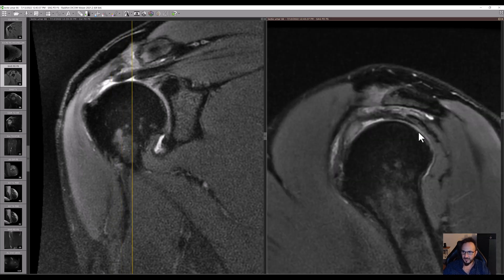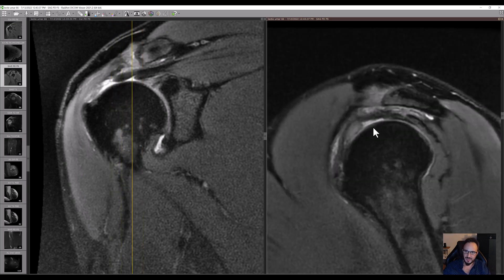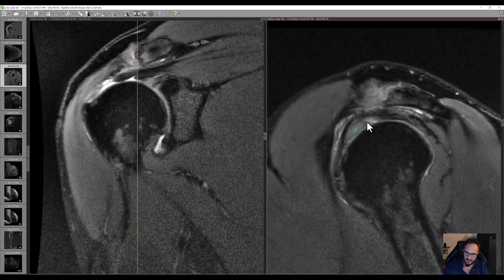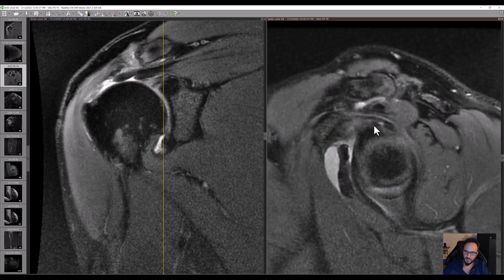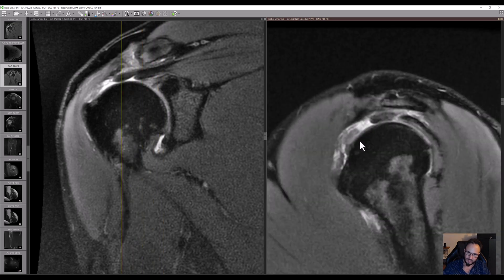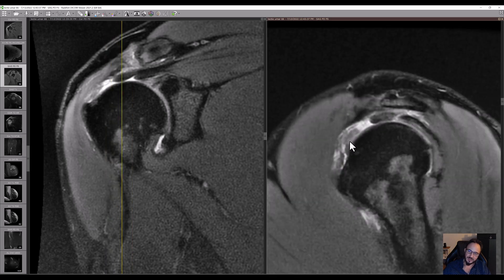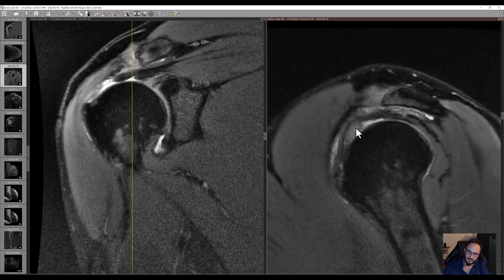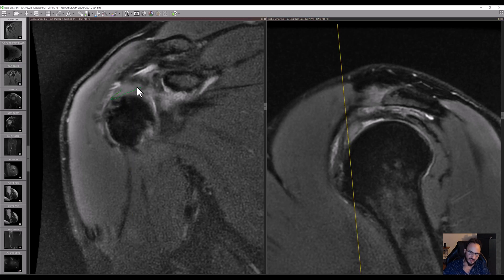There is also some tendinopathy of the infraspinatus, and of course bursitis. But what is this structure? If we follow this structure, we see it goes all the way to the supraglenoid of the scapula. So this is what's left of the long head of the biceps, which is torn, retracted inside the joint, and with important signal changes.